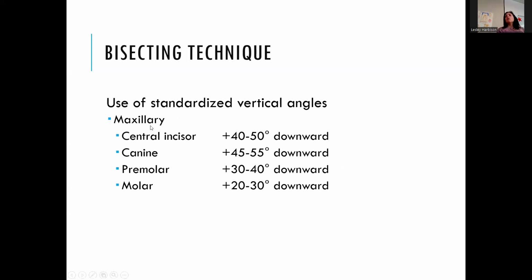When you're taking a maxillary central incisor and you have the film placed, you can place your film in Dexter and look at where Dexter's teeth are and where your film is, because we don't really have them closed down very much, we just rubber band it to hold it. So you can see, okay, here's my sensor, here are Dexter's teeth, and then just eyeball it. Literally, that's all. I can't explain it any better than that. You see those two angles and just imagine where the halfway point is. Make an image in your mind of that line, and then do what this says.